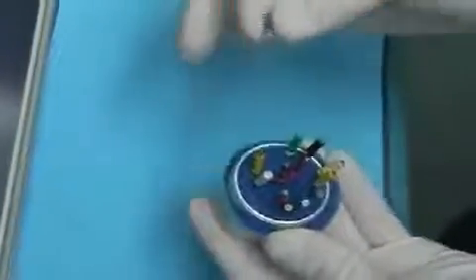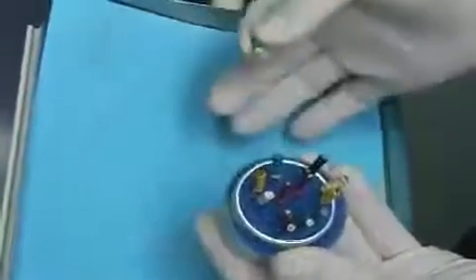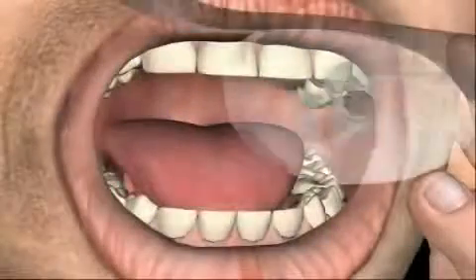With the aid of sterile instruments, the dentist can begin to clear and clean the interior of the tooth. Special solutions are used intermittently for rinsing in order to remove tooth chips, cell debris, and bacteria. It's important that all canals are reconditioned. Most teeth have several canals. Three of them are shown in this image, and the instrument is placed in one of them. Therefore, a precise and cautious dentist always works with magnification, such as medical magnifying glasses or even a microscope.